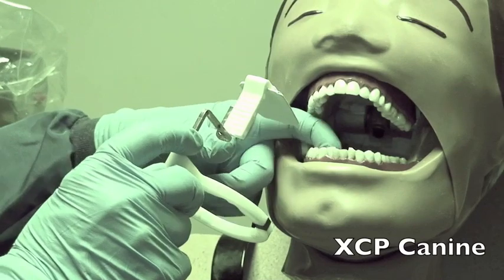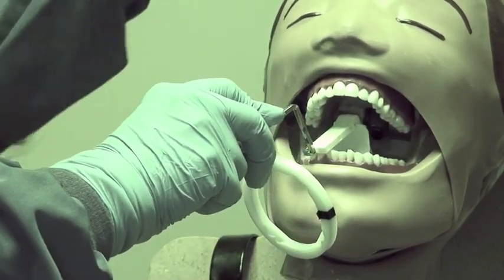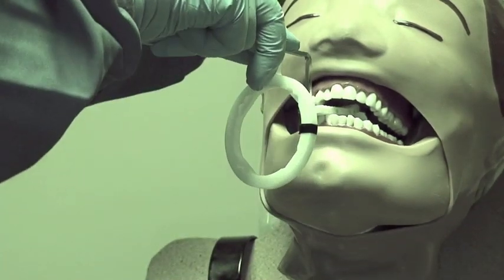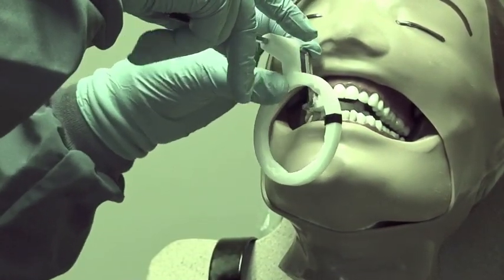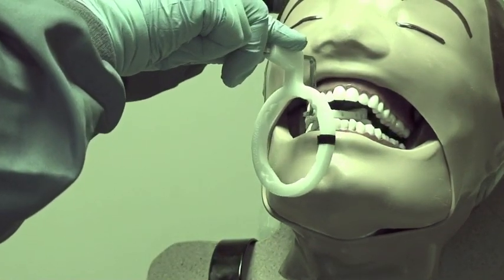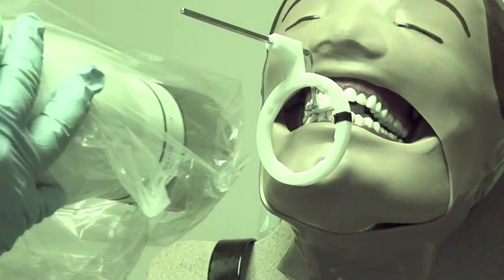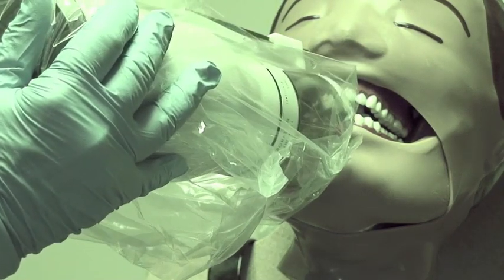After you do the canine, again dot in the slot, center the canine — you'll be pushing against the person's tongue. As they bite, bring the ring up and center it right over the canine. If it is crooked, just put a cotton roll in there to hold it so you stay centered over the canine. Then line up the PID.